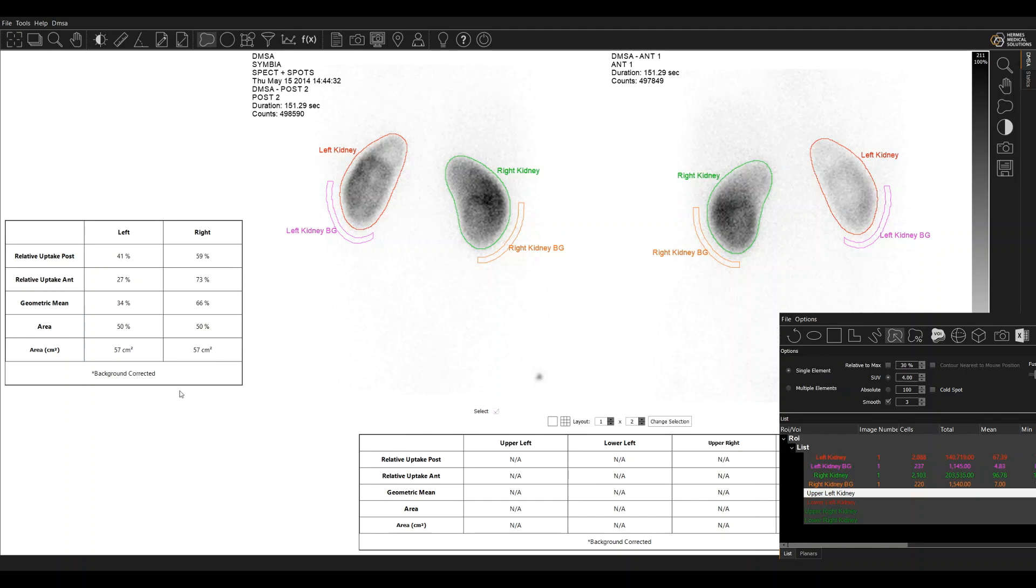This results table here is automatically calculated with the results. And so that's it, it's finished. Take a print screen and end for a normal DMSA case.